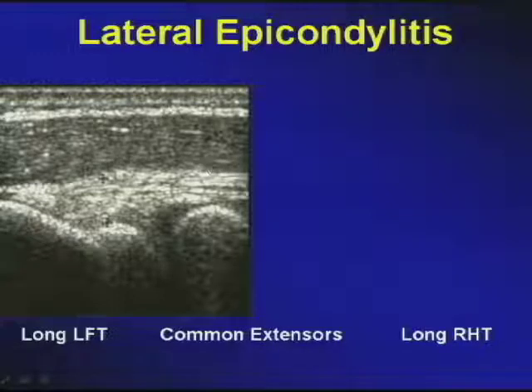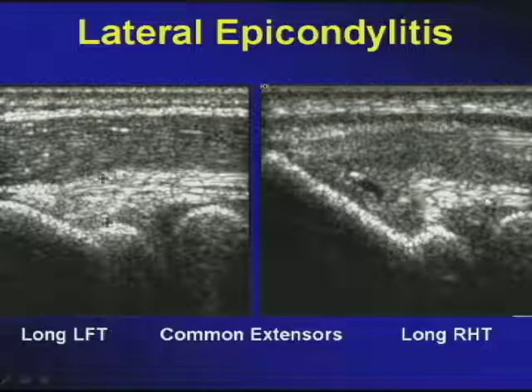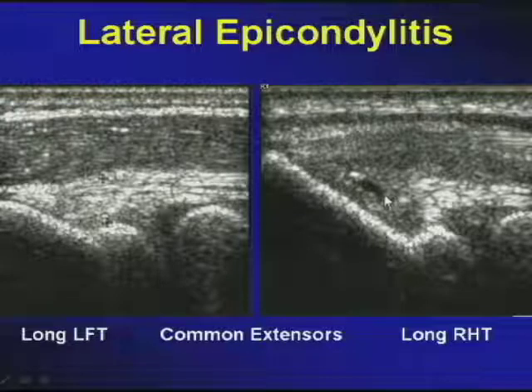When diseased, what you will get to see is first the fusiform hypoechoic swelling of the tendon, loss of the fibrillar pattern, and if you look at it carefully, not only do you see the increase in volume size, but also within the intrasubstance portions, you begin to detect hypoechoic defects representing mucoid degeneration or evolving partial thickness tears.